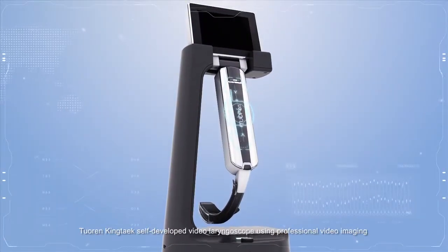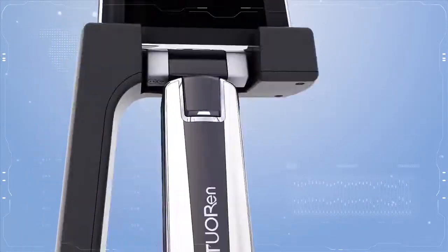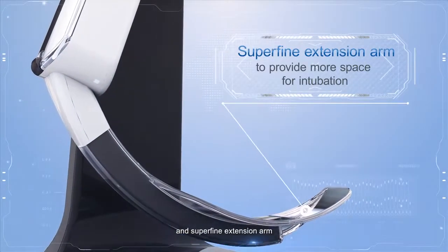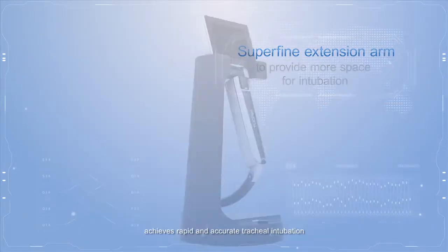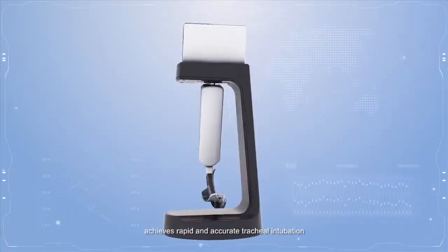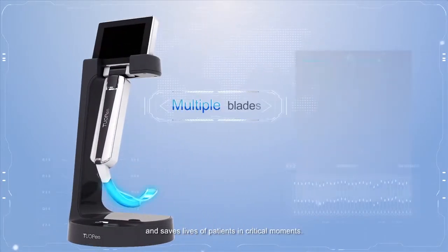Tuoren Kingtaek's self-developed video laryngoscope uses professional video imaging and a superfine extension arm to achieve rapid and accurate tracheal intubation, saving the lives of patients in critical moments.